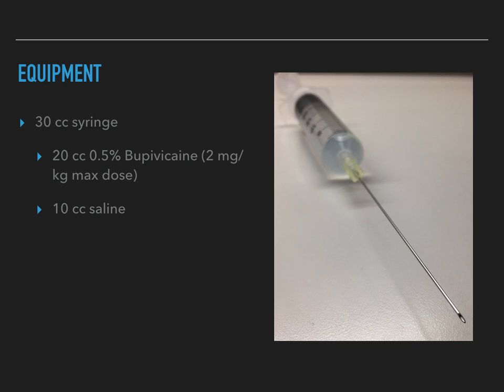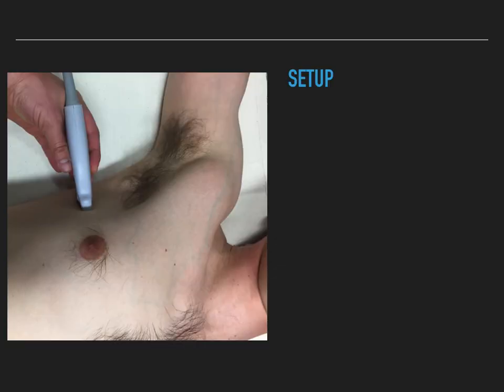Also realize that especially in polytrauma, the patient may be receiving other blocks or applications of local anesthetic, and the max dose is cumulative from all of these applications. Attach a 20-gauge spinal needle to your syringe, remembering that first you must remove the stylet. You will also need chlorhexidine for the skin. And because of the large volume of anesthetic and theoretical risk of toxicity, intralipids should be available in the Pyxis in your department.